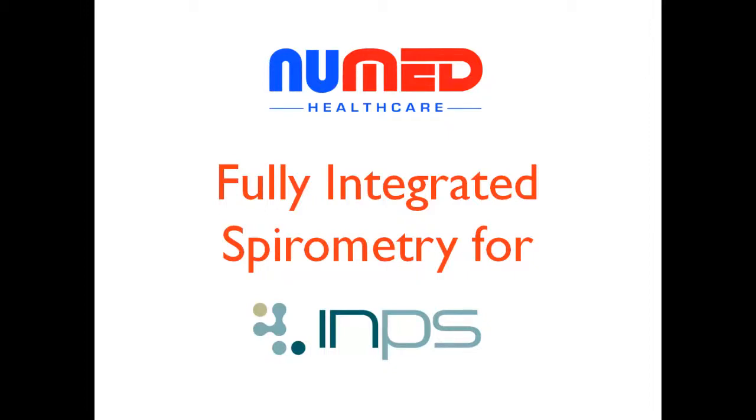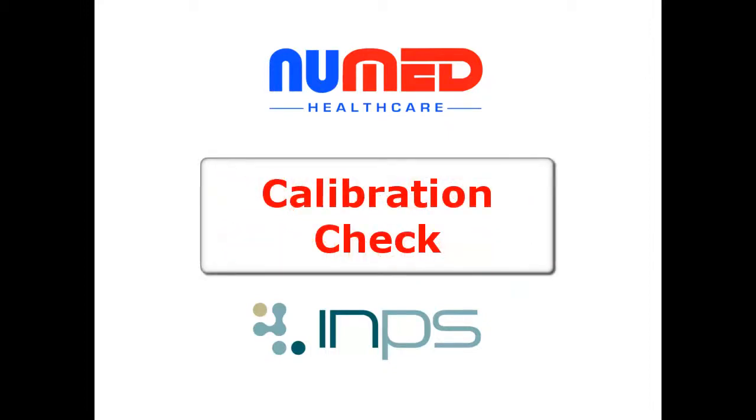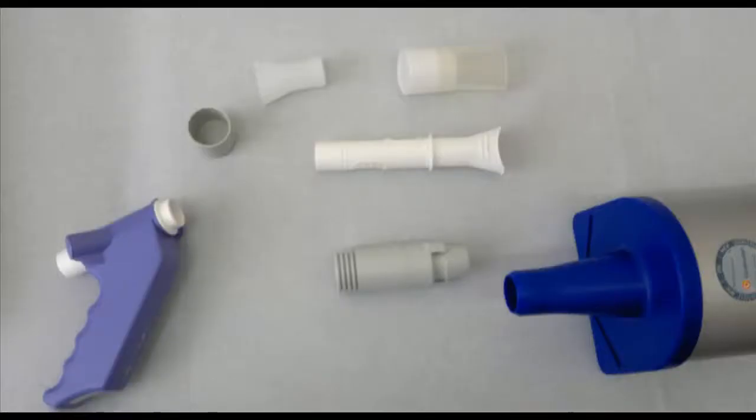This is a short screencast showing the calibration check of the TrueFlow spirometer using the adapter and calibration syringe.